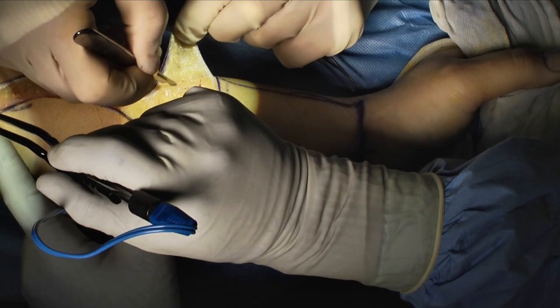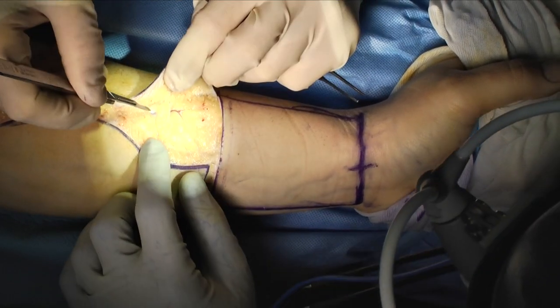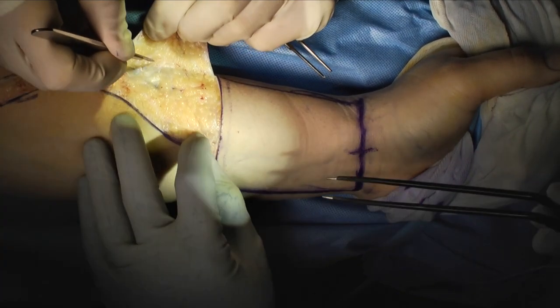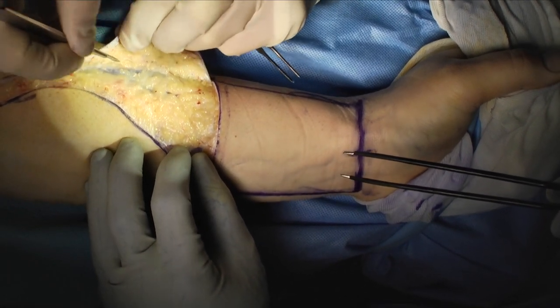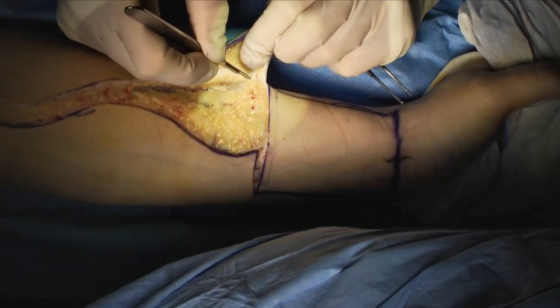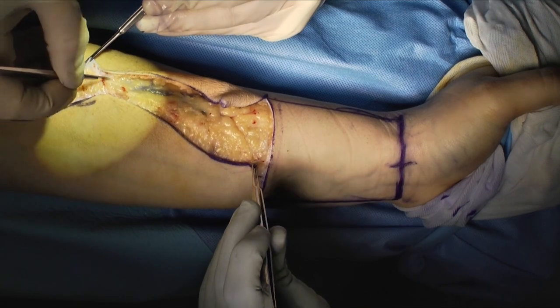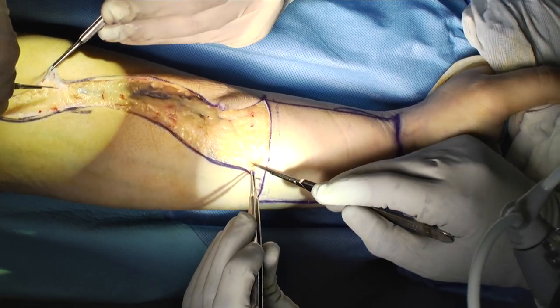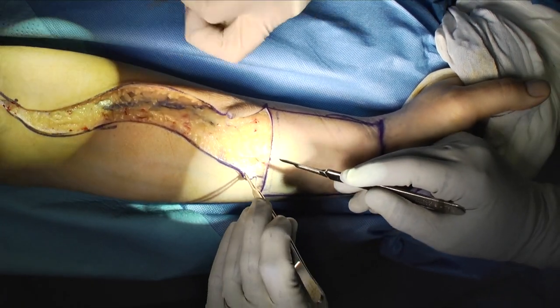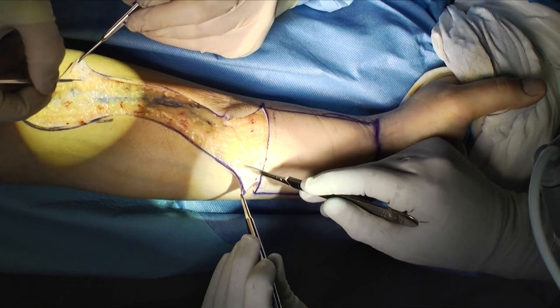If the skin is taken too thin during elevation, patients will wind up with necrosis, particularly on the distal aspect. The elevation is continued proximally in the forearm. Here you can see just beneath the fat the patient's cephalic vein. Small vessels are bipolar cauterized and larger ones are clipped with medium-sized clips. Two surgeons can work, one on each side of the arm. Typically the primary surgeon will sit on the radial side during this case.